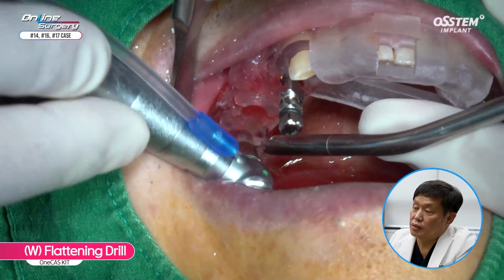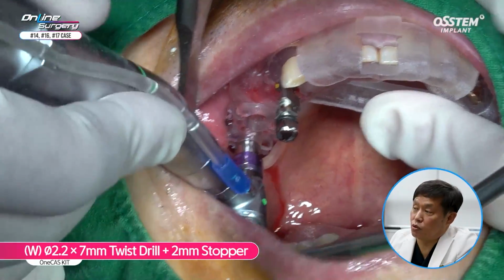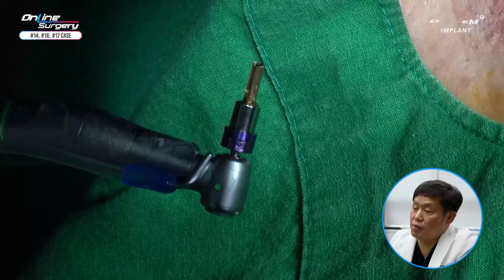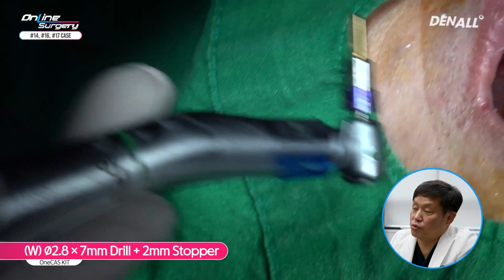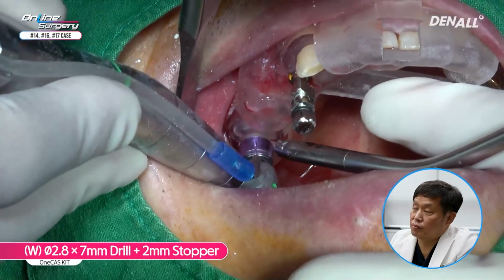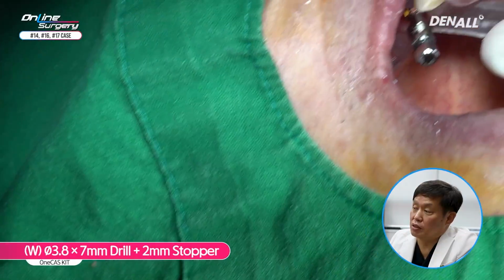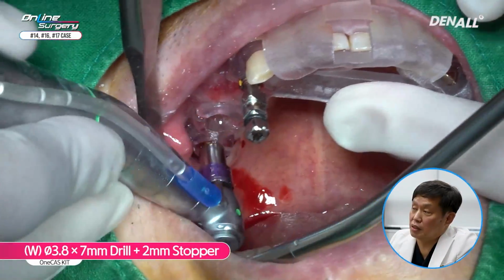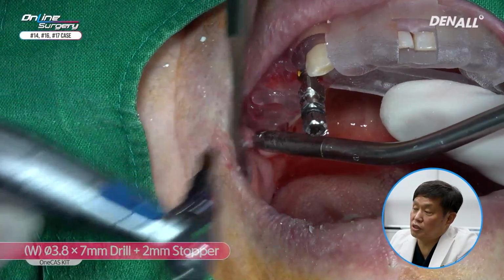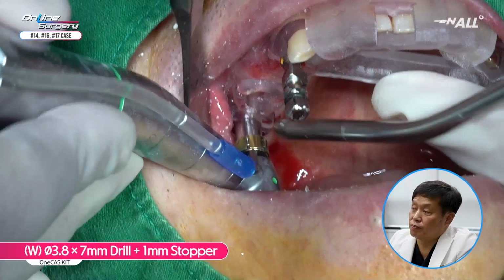So in number 17, flattening drill was used, and we assumed 6 millimeters here. 2.2 twisted drill with 2 millimeter stopper was used to drill up to 5 millimeters. The drill hole size is expanded using 2.8 by 7 millimeter drill with 2 millimeter stopper. OneCAS drill was used to drill up to 5 millimeters. 3.8 by 7 millimeter drill with 2 millimeter stopper. So drill hole size was expanded using this. Final drilling. Drilling was done up to 6 millimeters using 1 millimeter stopper.